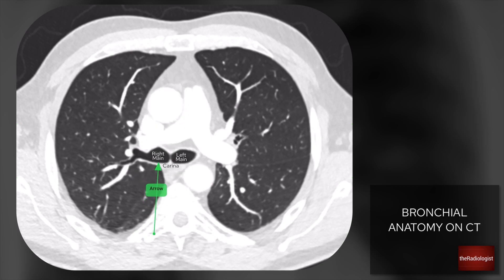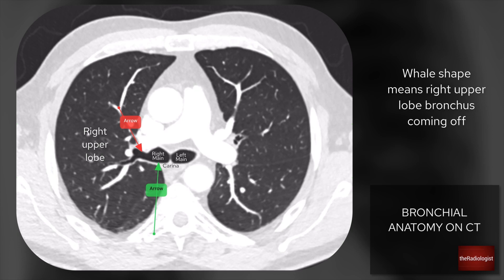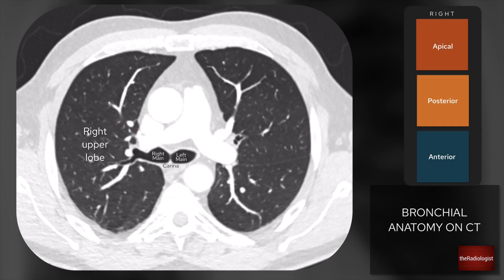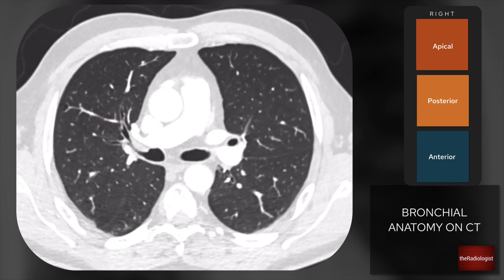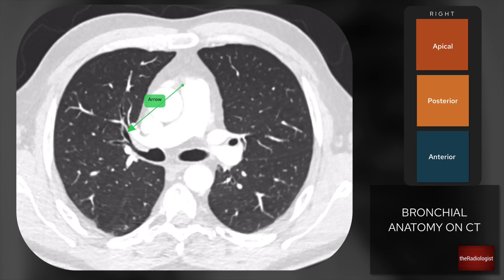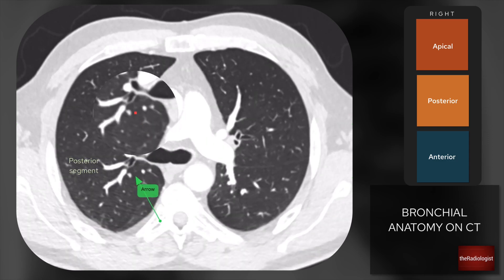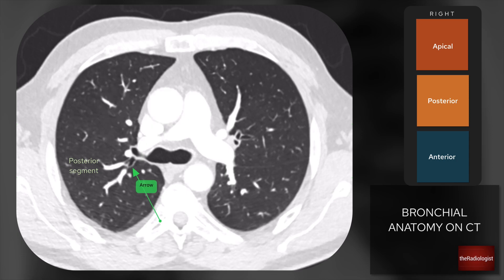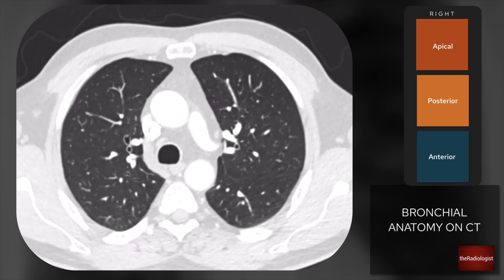On the right we can see this kind of whale shape here. Whenever I see this whale shape, that means you've got the right upper lobe bronchus coming off. So remember: the whale means right upper lobe bronchus. The right upper lobe then has three segments: apical, posterior and anterior. We can see the anterior segment coming off here going anteriorly, then the posterior segment coming off here, and the apical segment going towards the lung apex - three segments of your right upper lobe.